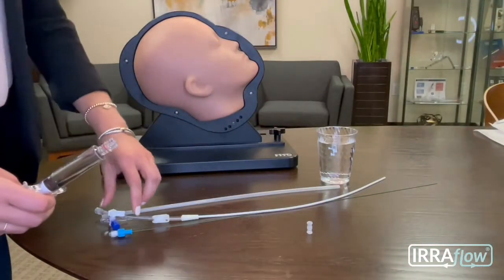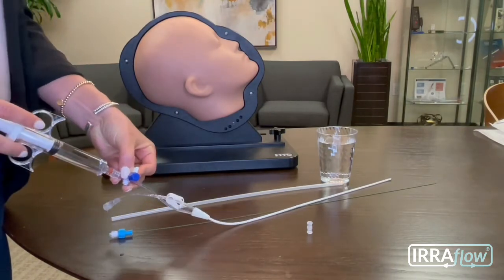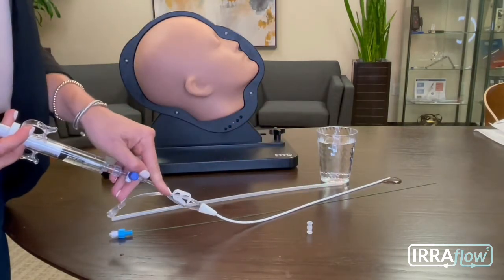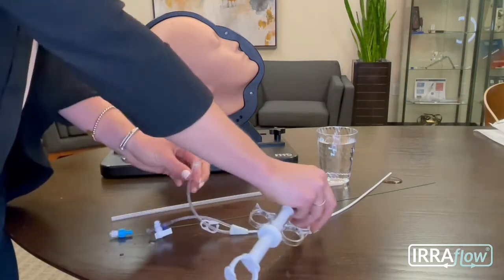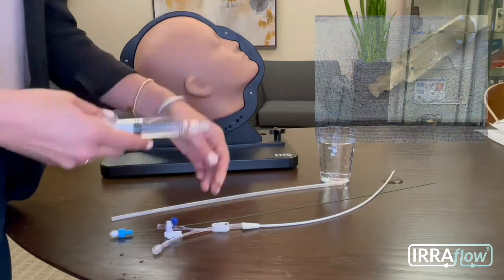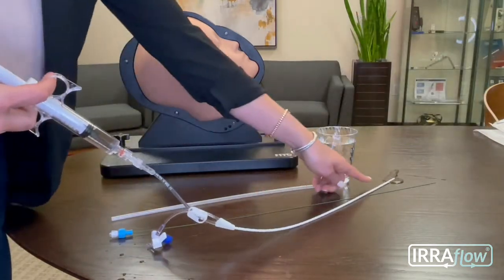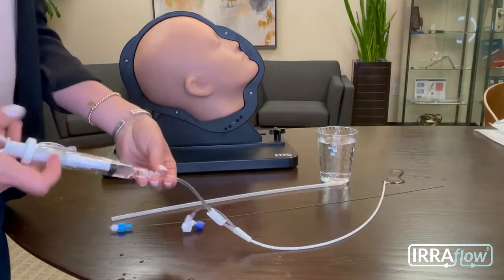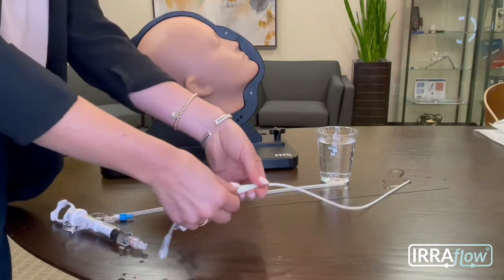To properly prep the IRRAflow catheter, you're going to want to ensure that you have a thorough flush. Starting with the irrigation lumen, you're going to want to turn off the stopcock to ensure there isn't fluid coming back towards you and it's lubricating the entirety of the catheter. Next, you'll need to flush the drainage lumen, utilizing the male-to-male connector, and thoroughly flushing the drainage lumen. You'll want to pay close attention that there is plenty of fluid exiting the tip of the catheter. Before disconnecting the syringe, make sure you clamp the drainage lumen to keep the lumen lubricated.